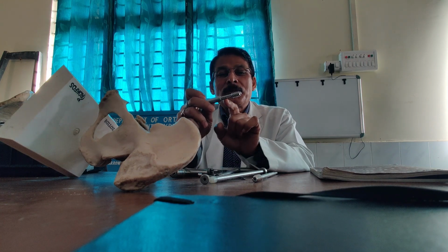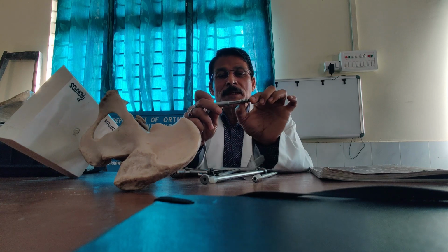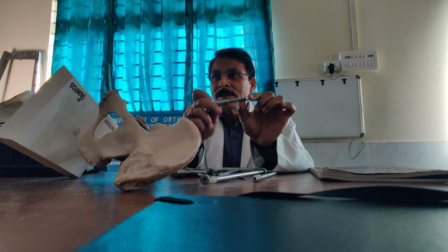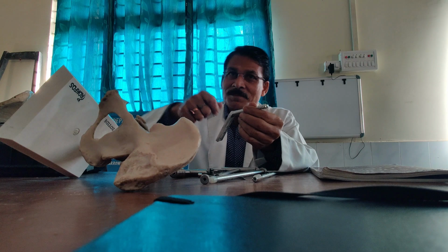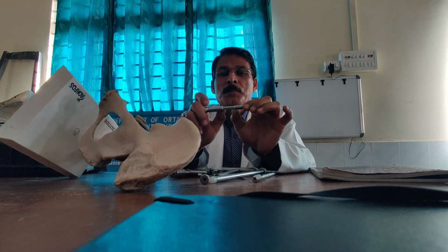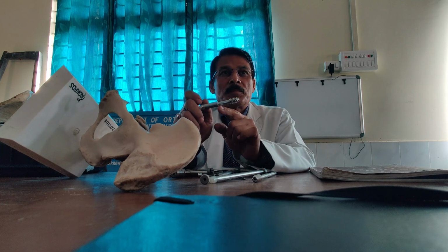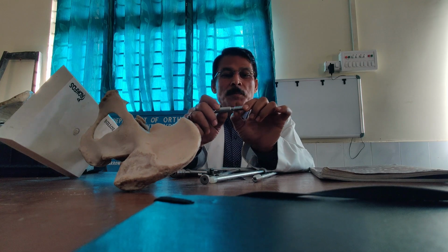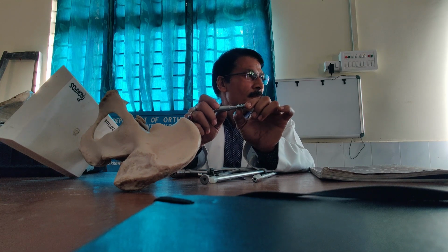Now, how much should be there in between the two, the threaded part and this? What is the size? 12.5. And pitch 3 mm. Yes, 3 mm pitch. This is almost 22. That means this part should be there in between the tip of the barrel and the base. So this part is going to help us with compression.